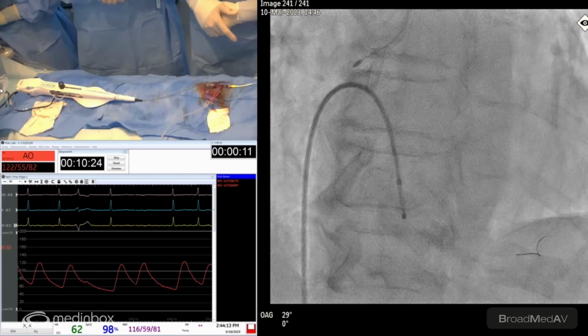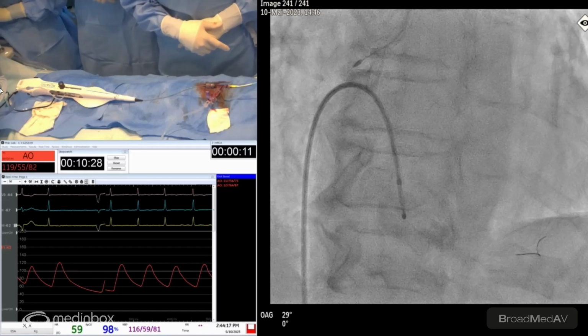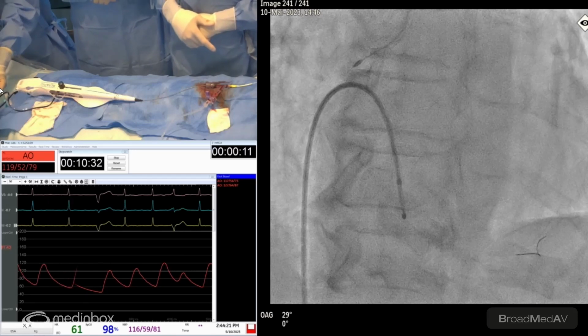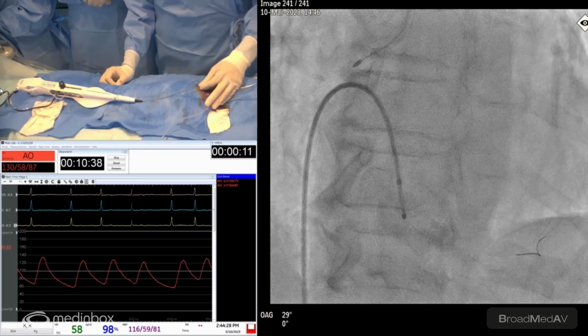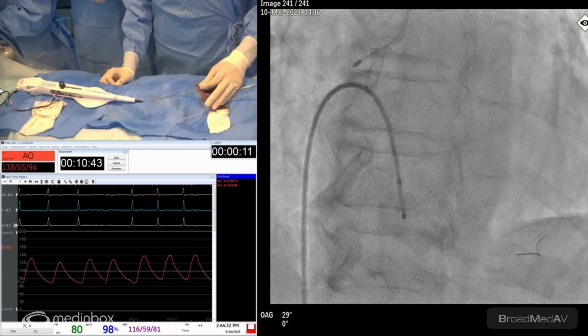And we're looking to avoid some too important decelerations here. We can hear it when it goes more higher pitched. We can look at the RPMs. If it drops too much, more than 5,000 RPM, we want to make sure there's no burr stall or more decelerations than that. Yeah.